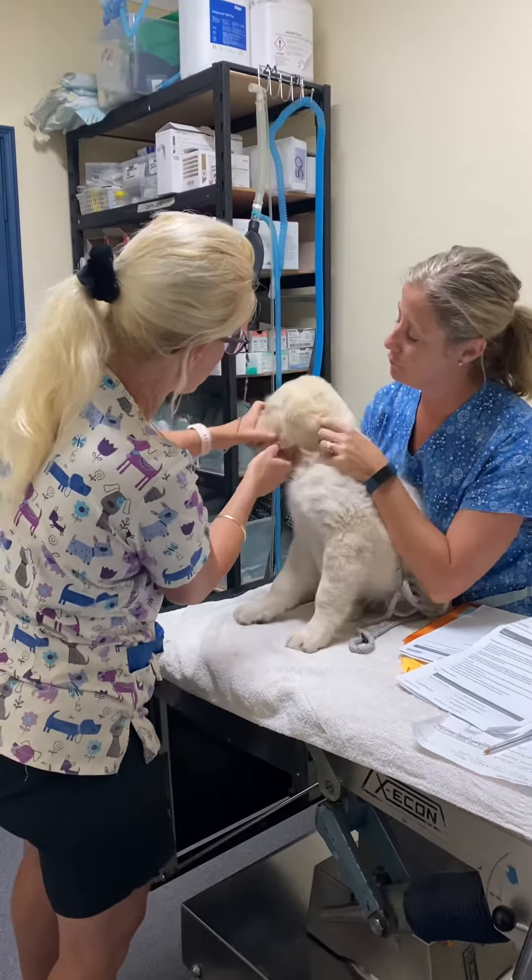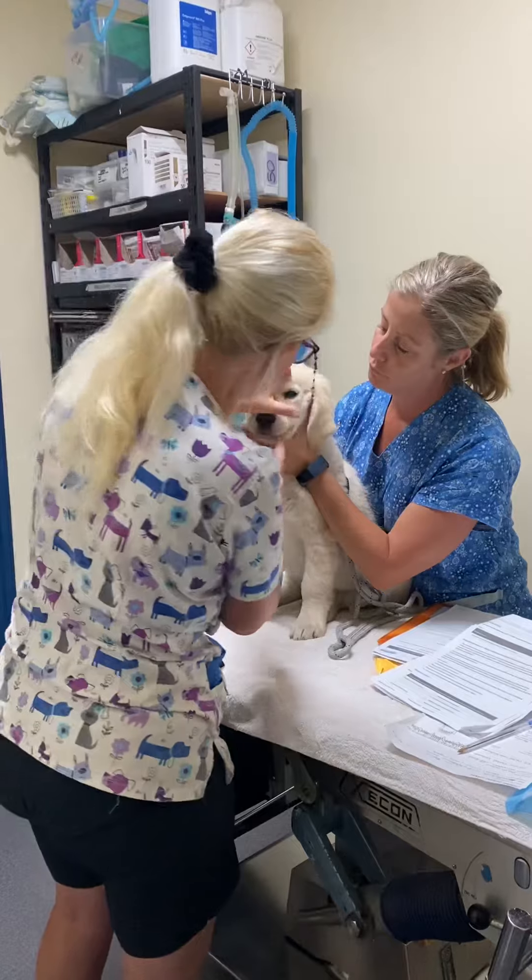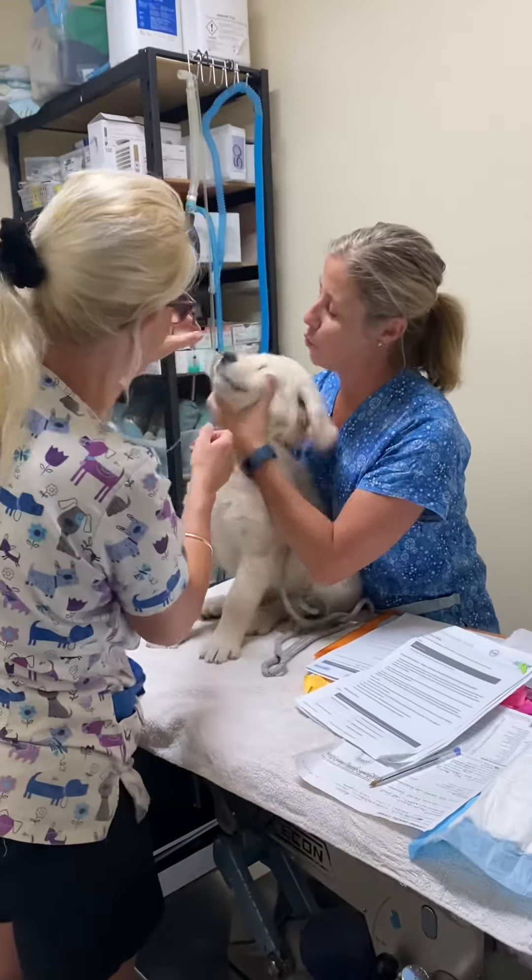We look at the gum. Working with our patient who's a puppy, so she's a bit of a wriggler now.